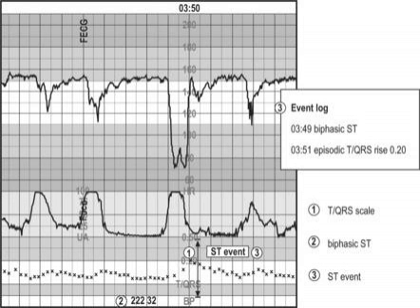This technology started in Sweden and spread throughout Europe during the 2000s before being approved for use in the US in 2007. Okay, so how does it work? Well, unlike traditional fetal heart rate monitoring, which abstracts the fetal EKG, as we have discussed in the first episode, ST waveform analysis looks at the raw EKG data obtained via fetal scalp electrode.